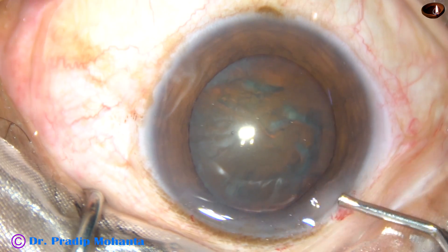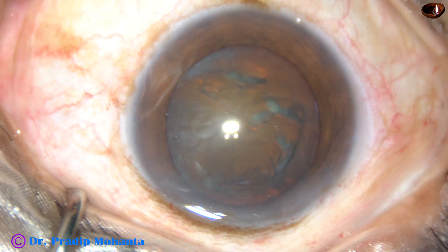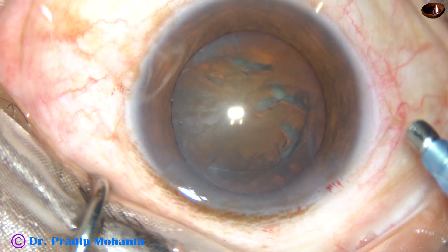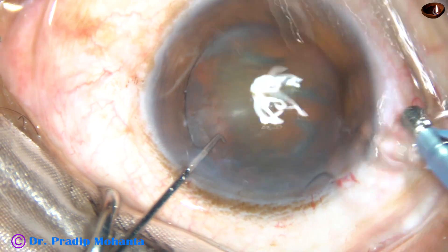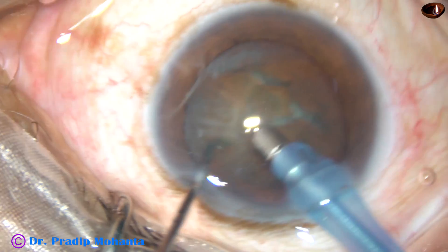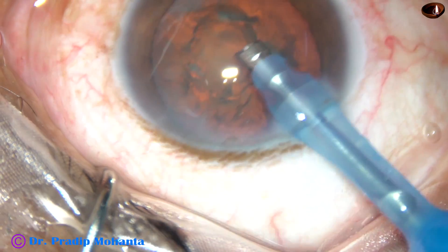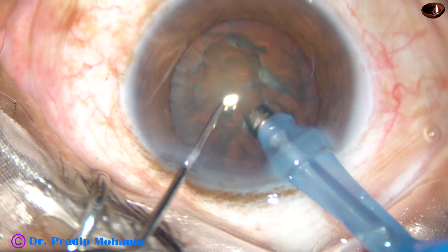Some 2% HPMC viscoelastic is injected into the anterior chamber. Then the tip of the FACO handpiece is introduced into the anterior chamber. This is an Oertli Cataract 3 FACO machine. I am in FACO 2 mode from the very beginning. Vacuum is 450 mmHg, flow rate is 45 ml per minute, and ultrasonic energy in this case is 60%.